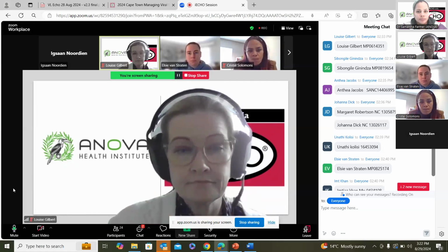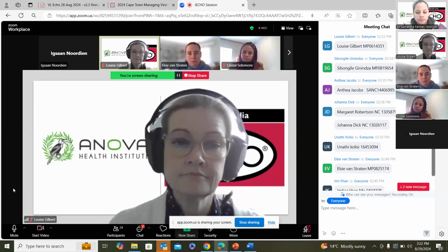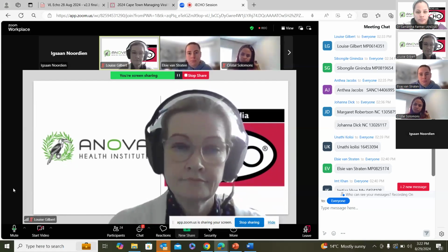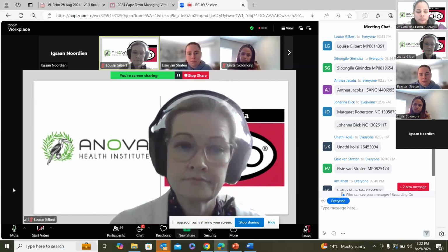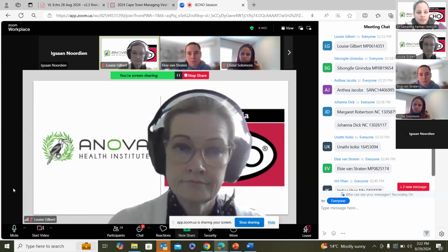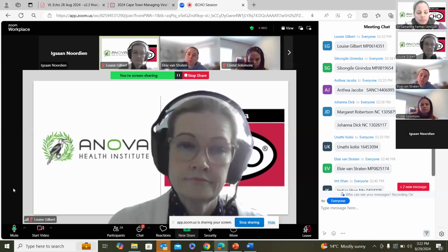Yeah, so one of my slides that I had, they did say you've got to have the right amount of blood for the right amount of additive in the tube. So you always have to fill the blood to the full line, because then the ratio of additive to blood is right. Now, I think internally we have pediatric tubes. So we have small purple top tubes, much like the adult size tube.